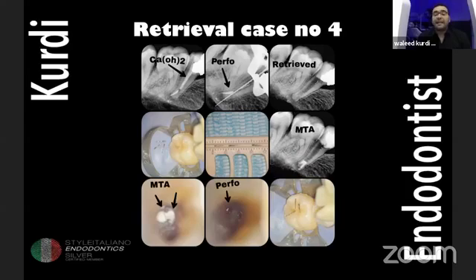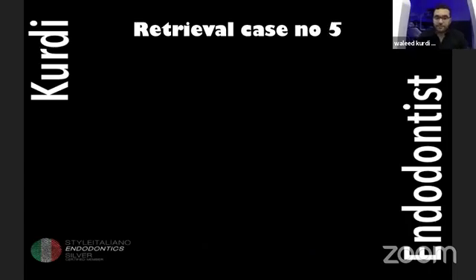It was not an easy case at all, because even the second premolar was a little bit mesially drifted inside the mouth of this patient, so handling these broken files was not easy. But I was able to remove the 3 separated instruments, and after that, as you can see, I closed the apex, and also closed the canal with MTA. Then after that, with gutta-percha, indeed.